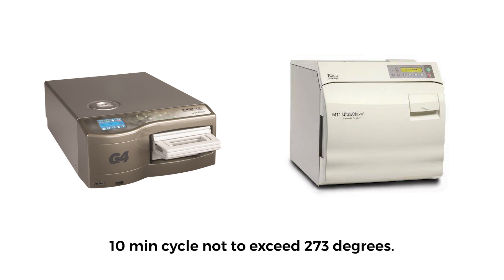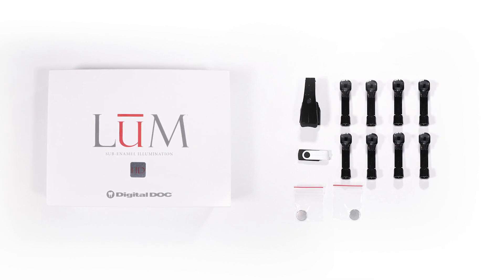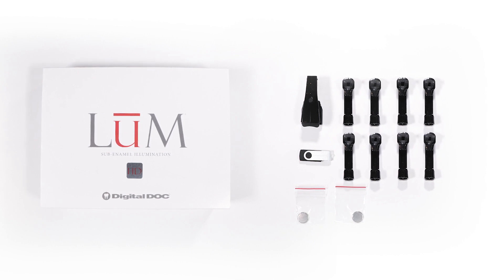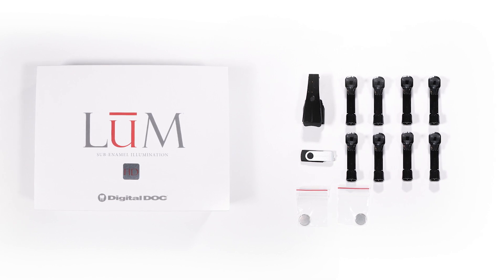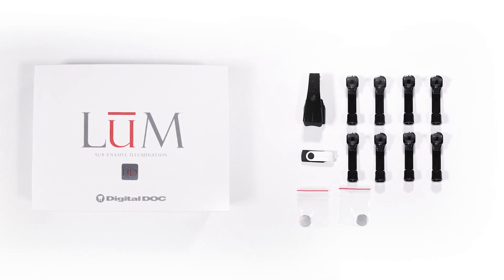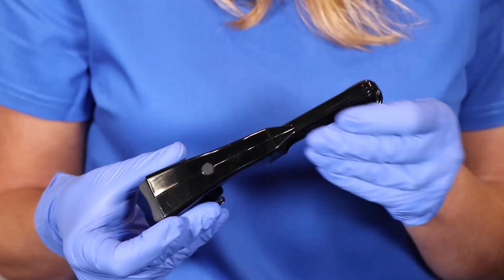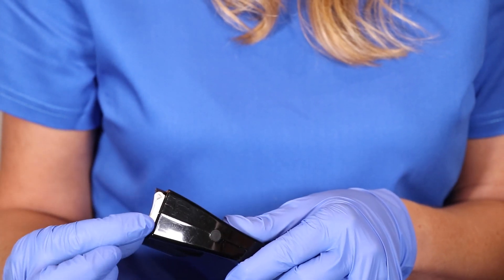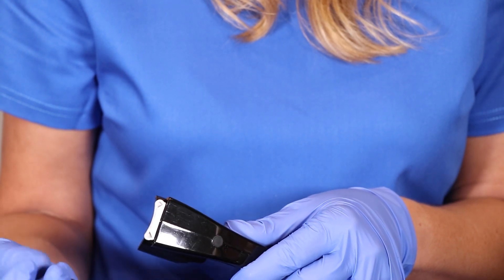The maximum temperature is 273 degrees. The loom box comes with eight tips. The goal is that for hygienists who see eight patients a day, there's a tip for each patient. If you're going to autoclave, you don't have to stop in between — just use a tip on each patient. You'll also see that there are multiple batteries for replacement. Simply remove the cap at the end of the loom, slide out the battery compartment, replace the battery, and push it back in.